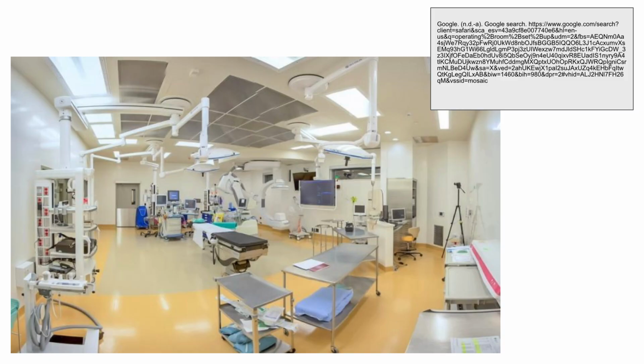Room setup for an XLAP uses a regular surgical table and is typically located in the center of the room, centered under the center of the boom arm of the lights. An anesthesia machine is located at the head of the patient. There's a Mayo stand and a back table that will be next to the Mayo stand, and a suction or Neptune machine.